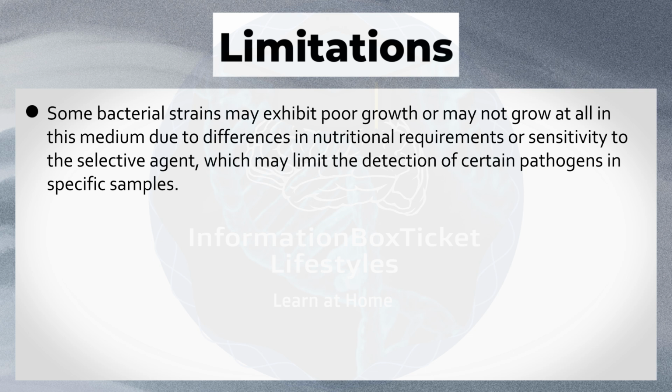Some bacterial strains may exhibit poor growth or may not grow at all in this medium due to differences in nutritional requirements or sensitivity to the selective agent, which may limit the detection of certain pathogens in specific samples.